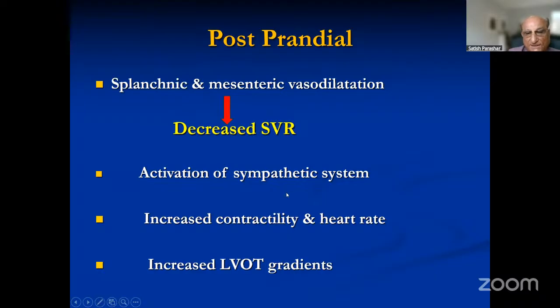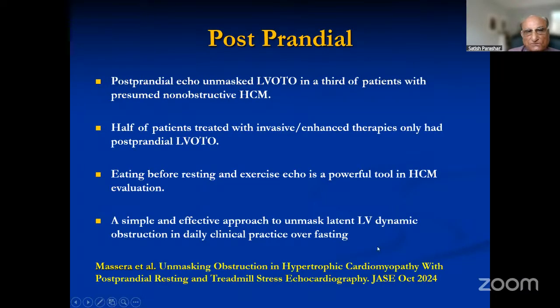And in one of the journals, October 2024, they said that a postprandial echo unmasked LVOT obstruction in almost one-third of patients with presumed non-obstructive HCM. Half of the patients treated with invasive or enhanced therapeutics only had a postprandial LVOT obstruction.